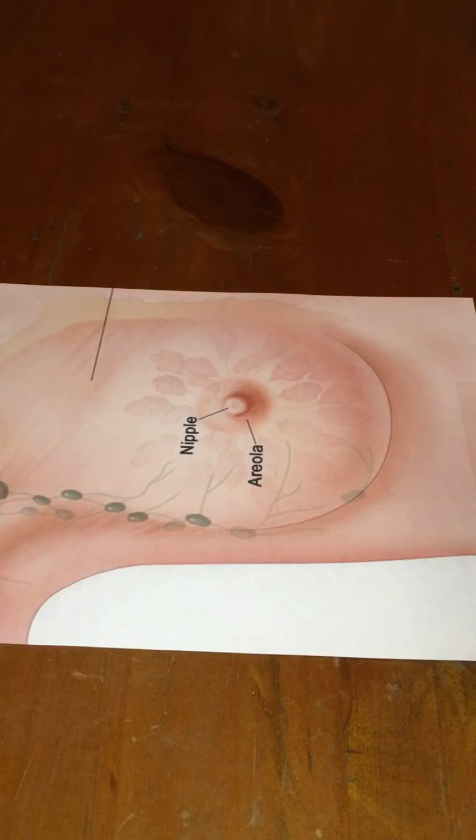Today I'll be demonstrating the radial and anti-radial scanning technique. I'm going to start off with the radial technique.